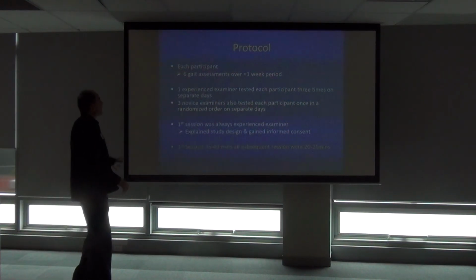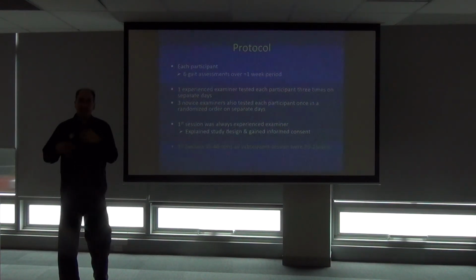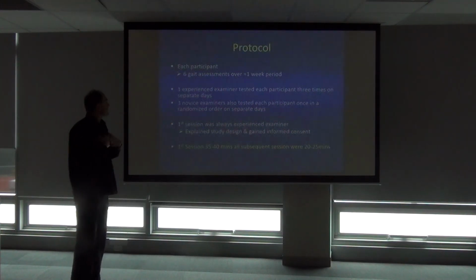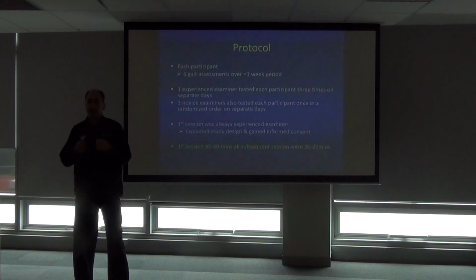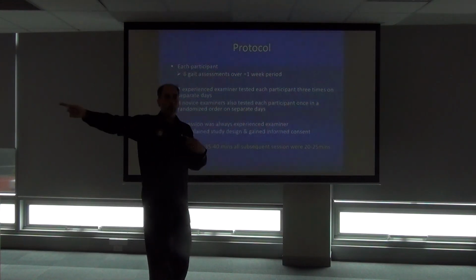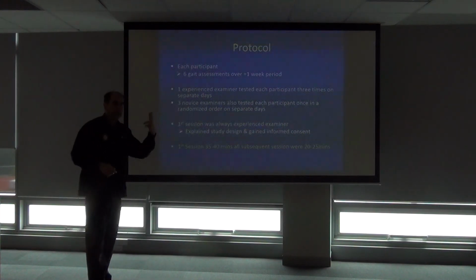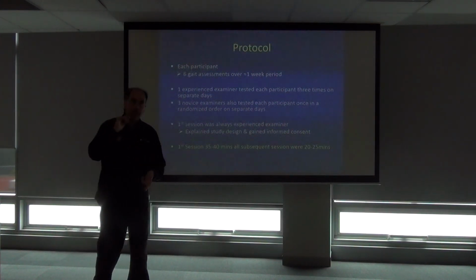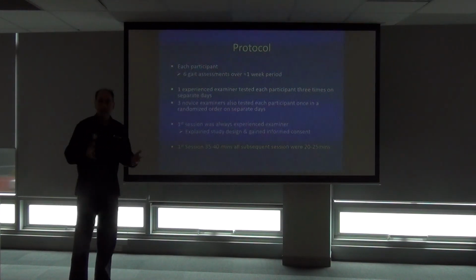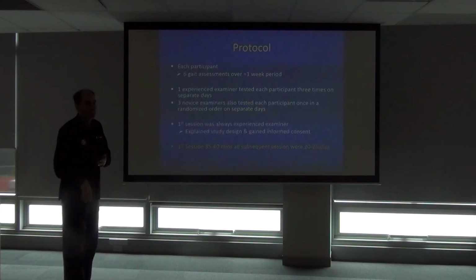Protocol. Each participant underwent 6 gait assessments. Okay, so 6. Me as experienced examiner, I was the experienced one. I tested each participant on 3 separate days over a 1-week period, and there were 3 other examiners. They were 4th year physiotherapy students for the novice. They had 1 afternoon training in all this stuff. That was it, and then they were let loose.